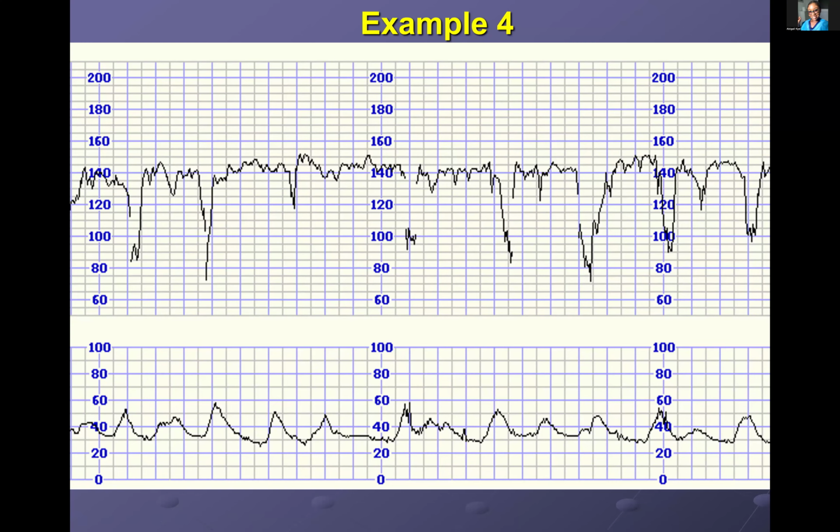So she's contracting quite regularly, and again, it's not surprising because this is her 4th pregnancy. Even though she's not being induced or augmented, that's understandable, and she's at 39 weeks. So that's your contraction. She's definitely contracting on a regular basis.